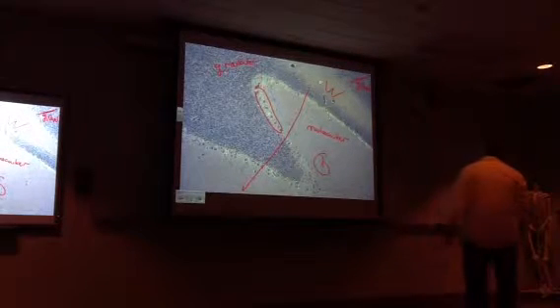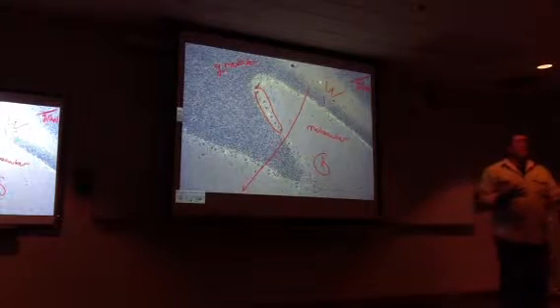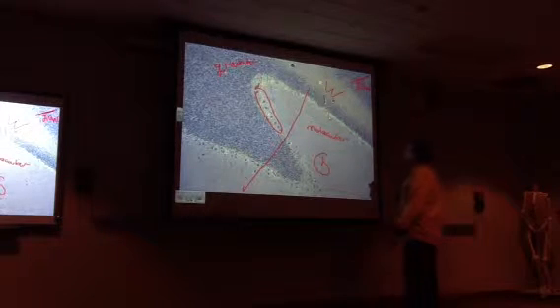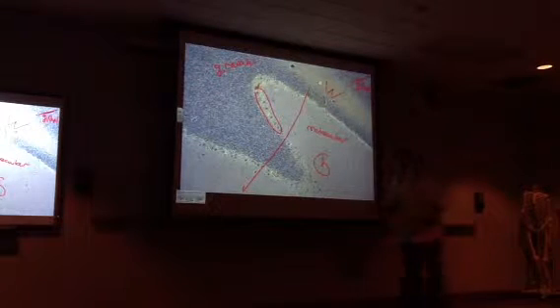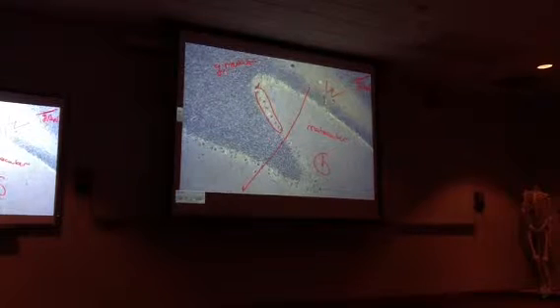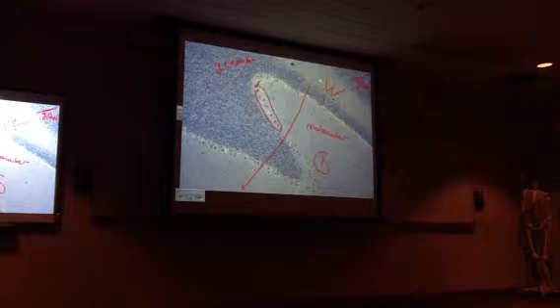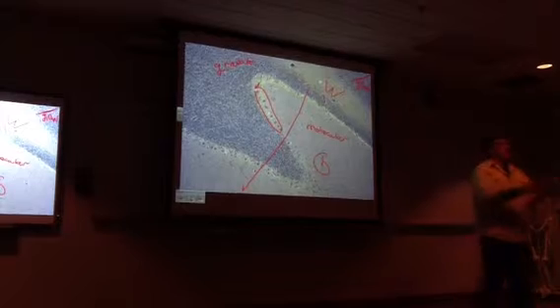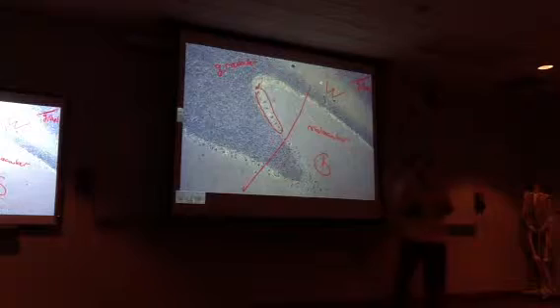If you think about it, what is white matter? Myelinated axons, okay? And so if you think about it, you've got these cells in the granular layer, which are probably interneurons. Did Dr. Defoe, I couldn't be here for that lecture. Did he talk about interneurons? Okay, so a lot of these cells in this granular layer could be interneurons, and they're going to send their axons out into white matter. Right.